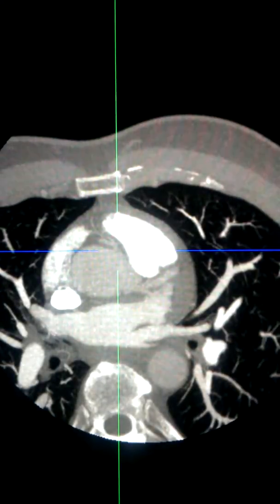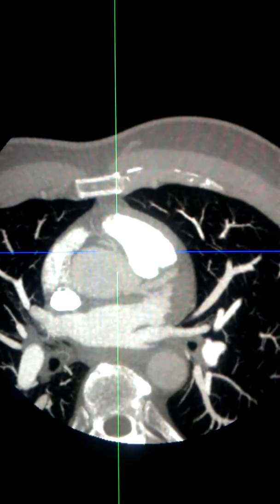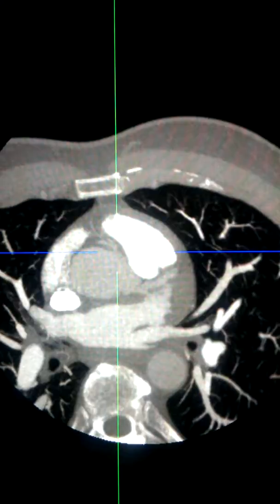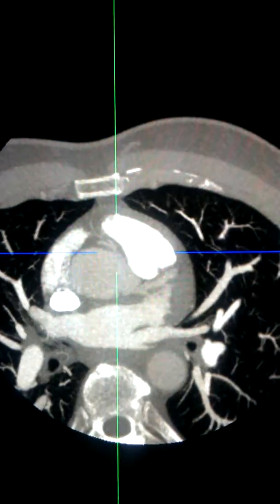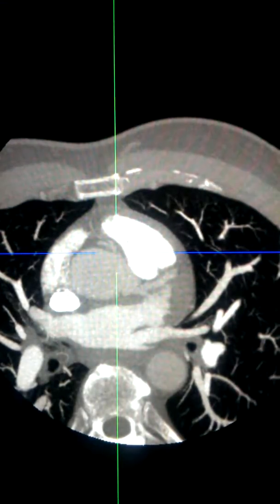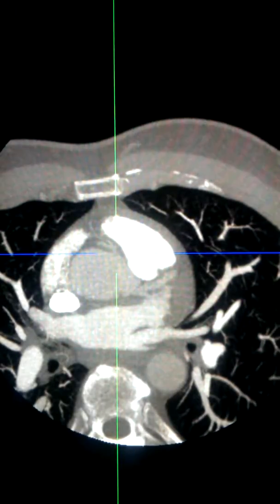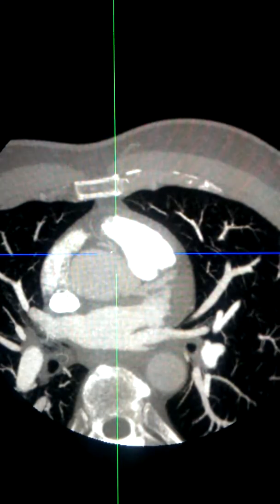This case illustrates an example of a coronary arterial variant — in this case, an anomalous origin of the right coronary artery.